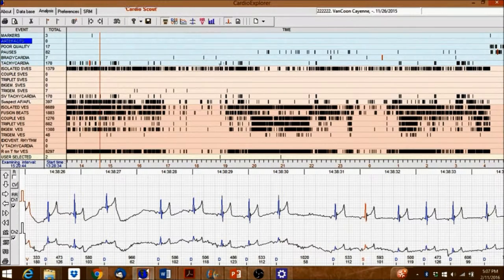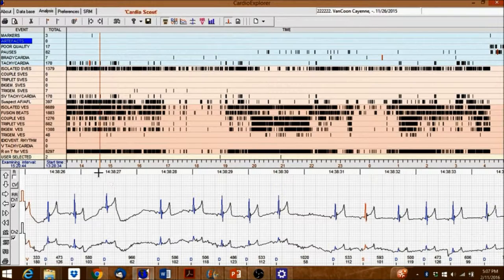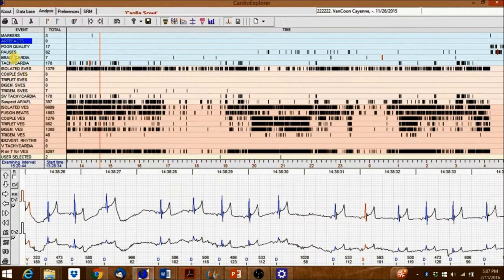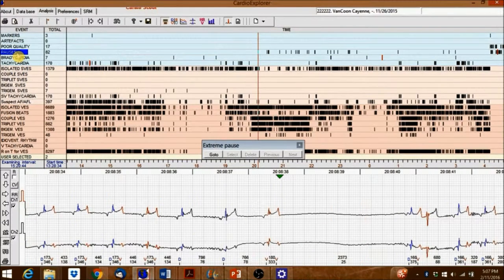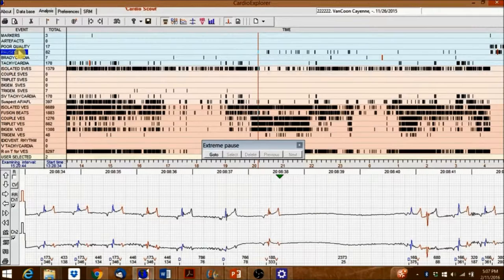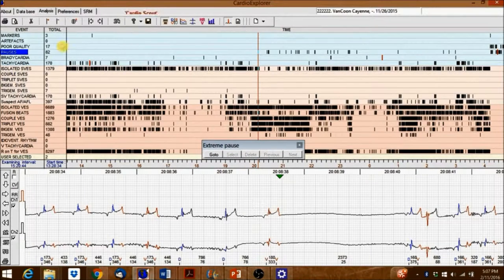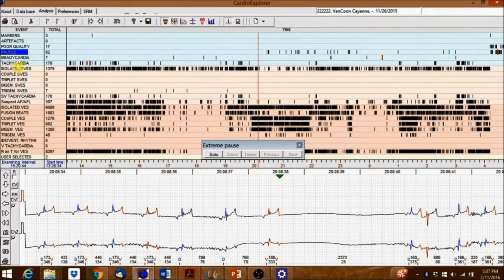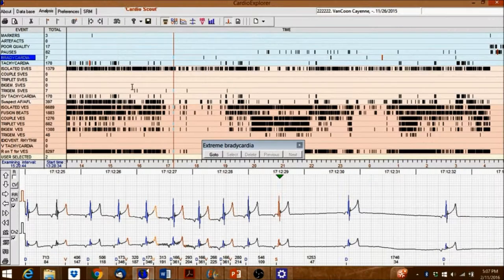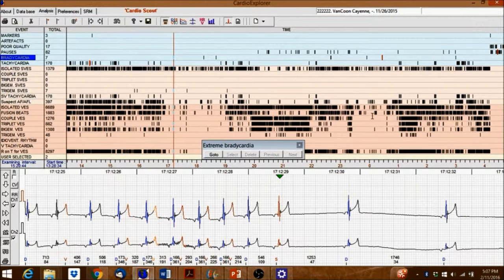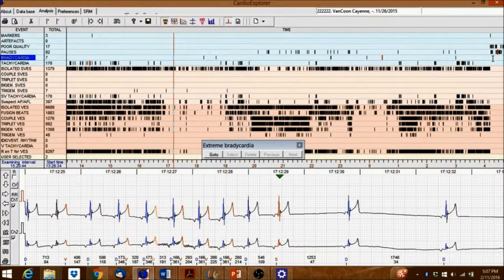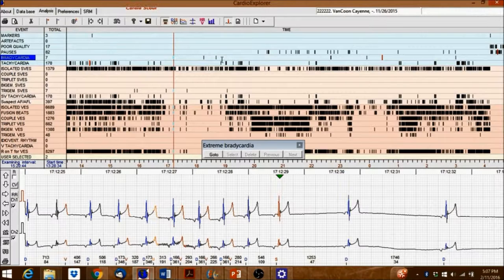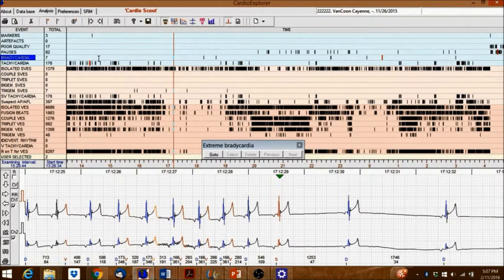Now click on an Event Category. You can see that the vertical red bar jumped to the first event in that category. The three small red markers inside the event window indicate the system Max Pause, Bradycardia, and Tachycardia.